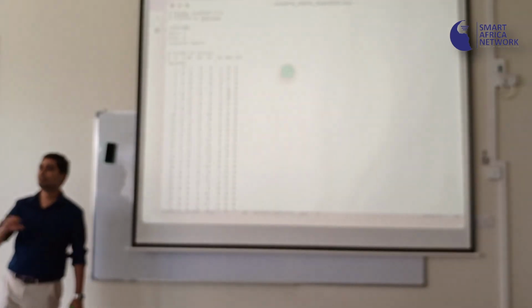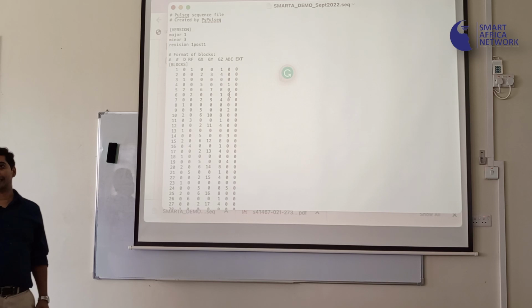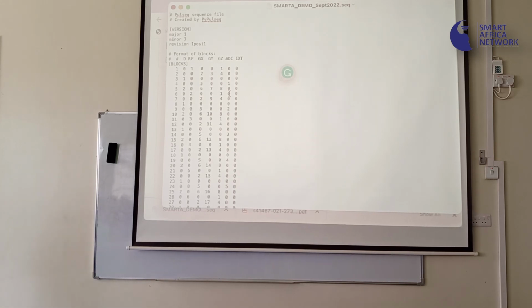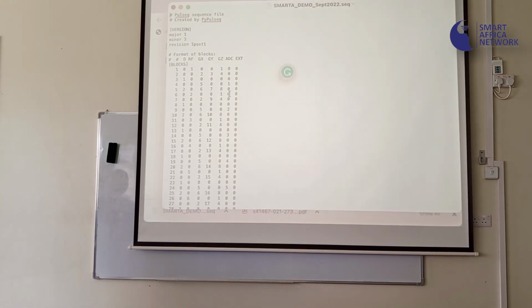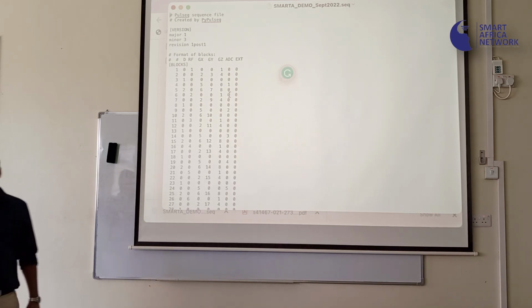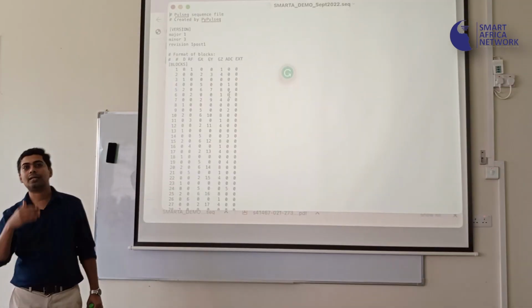You can match this with the timing diagram that you see on your Google Colab page. The first block will have an RF played out along with GZ. You can check that. If you look at the first things that happen, there's the RF and GZ to selectively excite a slab or a slice. Then you have GX and GY coming next in time. Then you have a delay, meaning nothing is happening, and then you have the readout gradient and the ADC. So this is telling you what is happening in time.